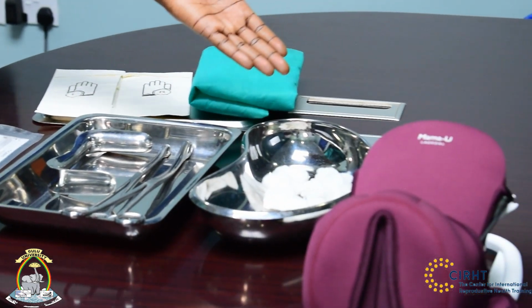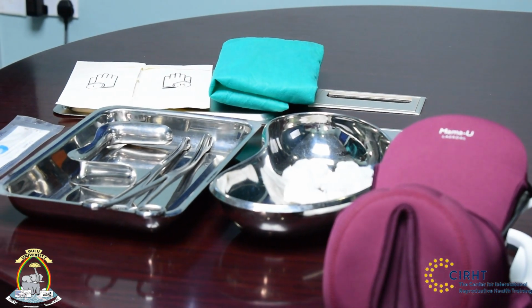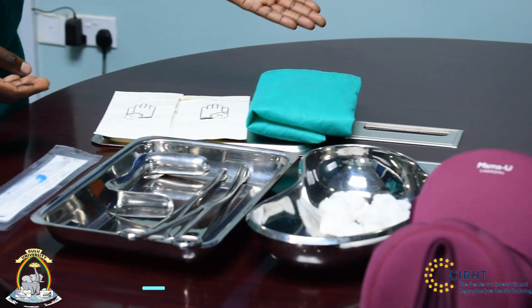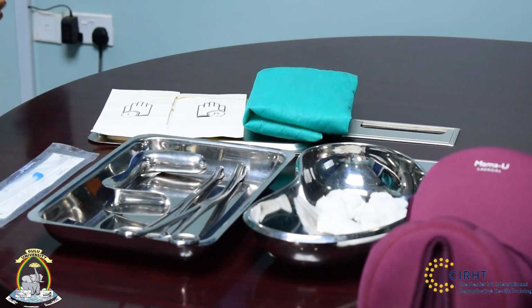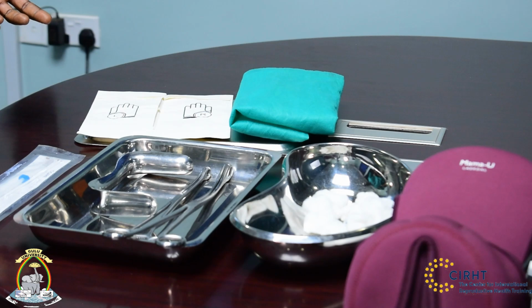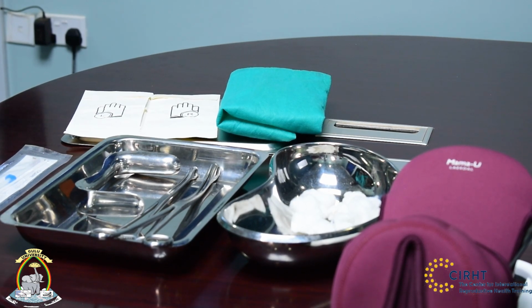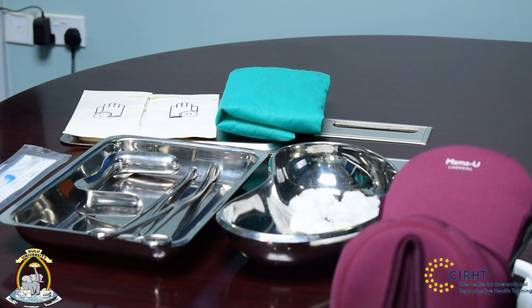And then we have swabs in a disinfectant solution. And then we have our high-level disinfected gloves, sterile gloves. And then we also have a piece of towel for placing on the mother's abdomen because we shall be trying to maintain an aseptic environment. So we need not to be touching the mother's abdomen. Remember, we have to elevate the uterus at some point as we're doing this procedure. So as we're touching on the abdomen, we do not need to be touching the abdomen using our sterile gloves.